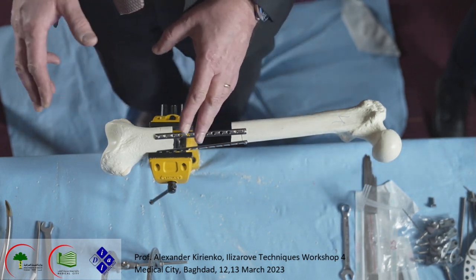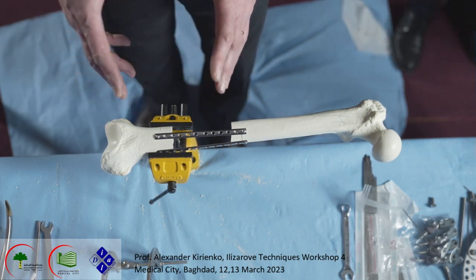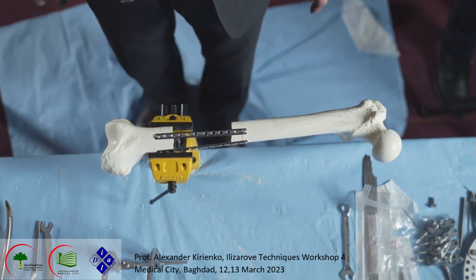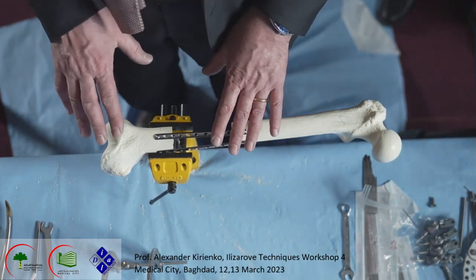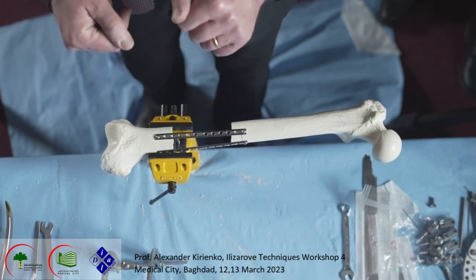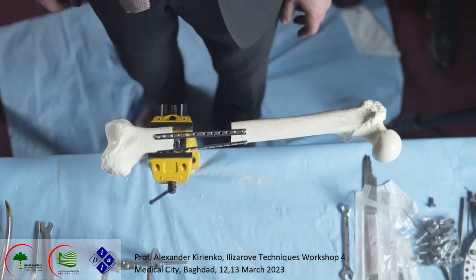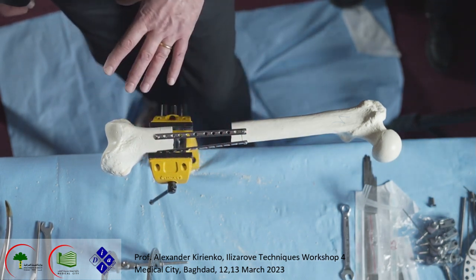Like I explained to you with the tibia, it's difficult to say that in each case there is a standard treatment. There are different cases, different approaches of treatment. When we do a defect of the femur, we try in the beginning to start the frame when I do surgery of resection, cleaning of the osteomyelitis or bone defect or pseudarthrosis.